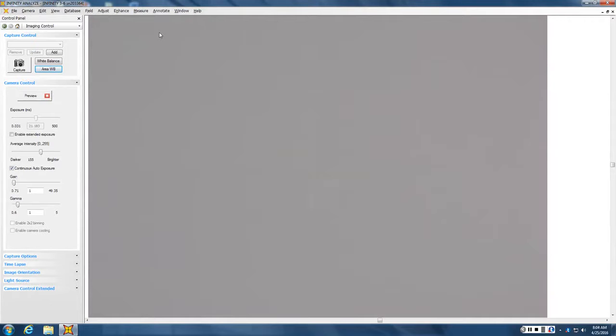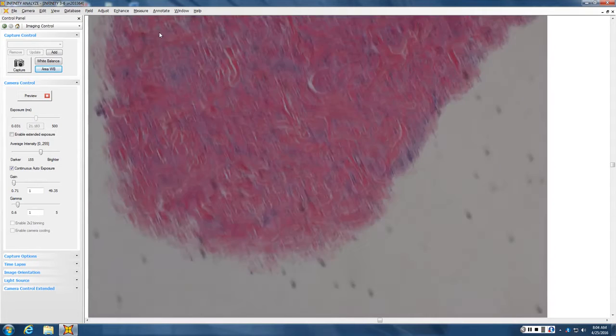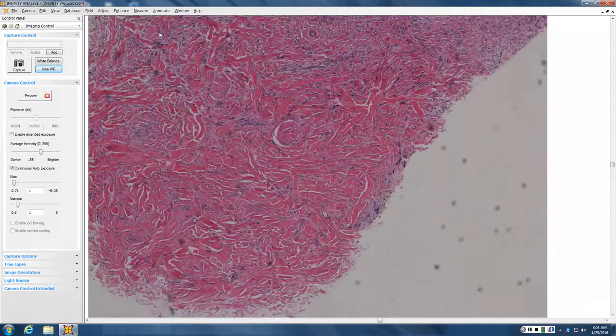Just want to make sure. There were a few other choriocarcinoma patterns. You can see the large syncytial cells, but you can get choriodifferentiation in lung and other things as well. So, okay, how about this one?